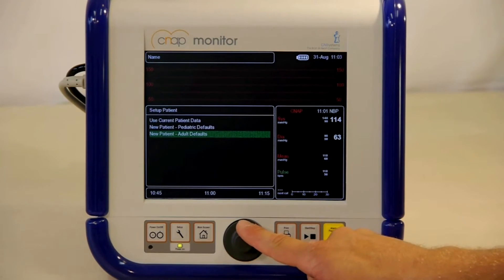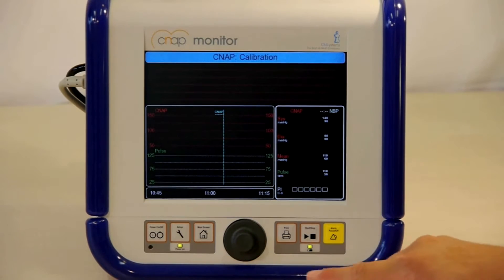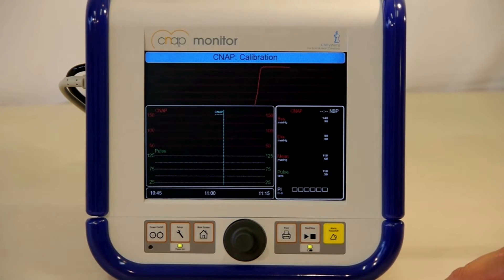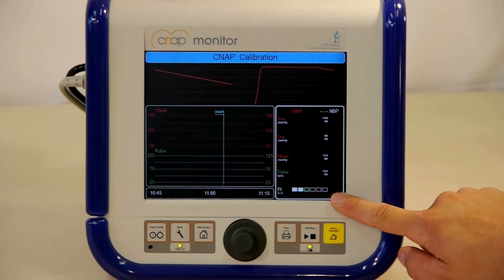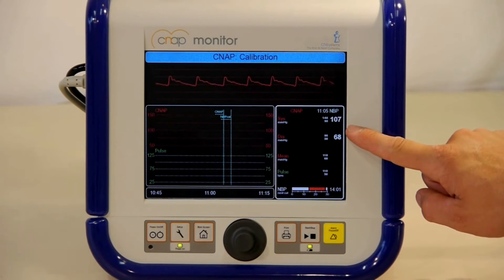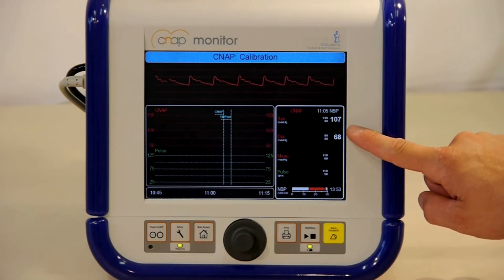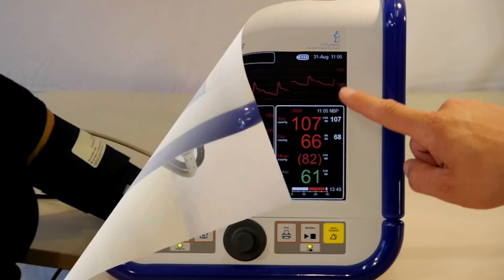Make sure to select the proper patient category — either adult or pediatric — as the selection will have an impact on inflation pressures for the upper arm cuff. The perfusion index shows the blood flow in the patient's fingers. When the perfusion index turns green, it indicates sufficient perfusion to start a measurement. The upper arm cuff will inflate and display the patient's brachial pressure, which is then calibrated with the finger cuff. The CNAP signal will then be displayed continuously.